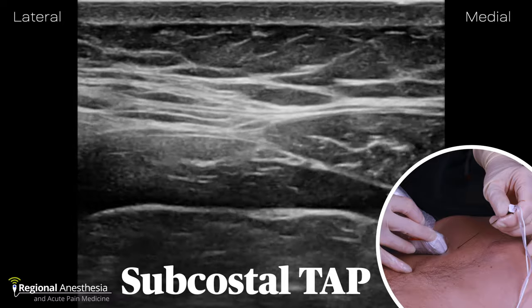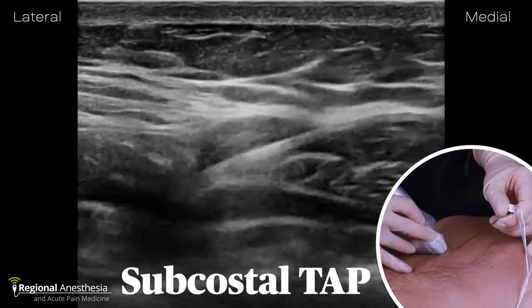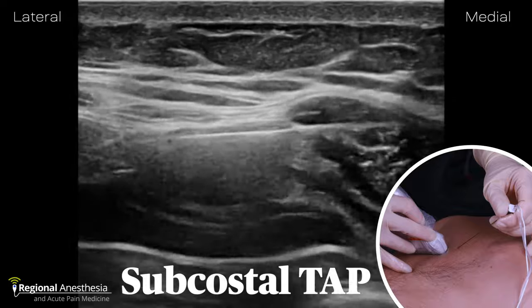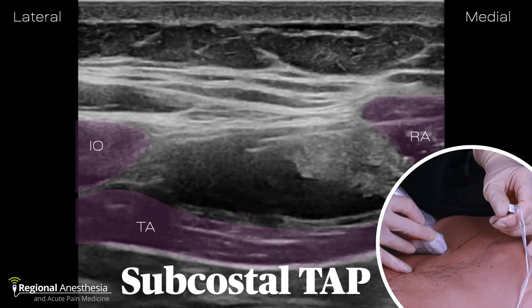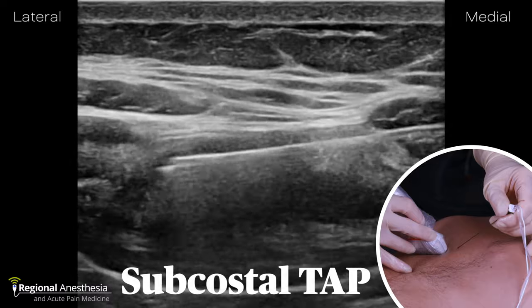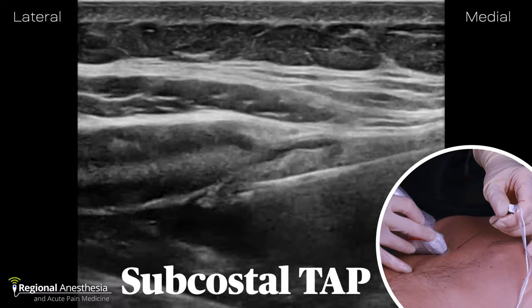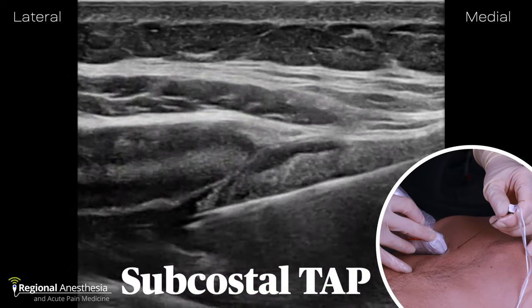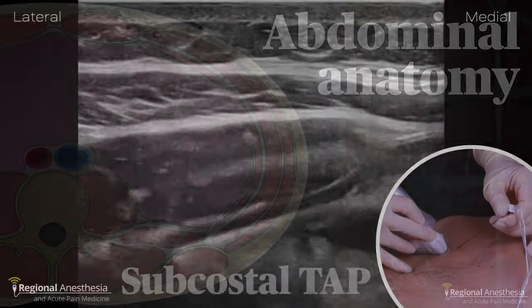One of these is the oblique subcostal TAP block. The idea here is to place local anesthetic just below the costal margin in the plane superficial to the transversus abdominis muscle. You can see the local anesthetic peeling apart that plane between rectus abdominis and the transversus, continuing to unzipper that same plane as the needle is advanced laterally and caudally, ending up between internal oblique and transversus.